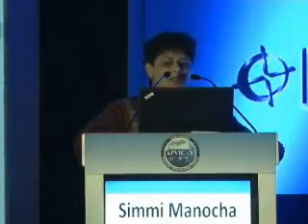The preset selection, this kind of option is always there. We have to choose which kind of preset we want to take up, whether it is vascular work or a small part ultrasound, etc.